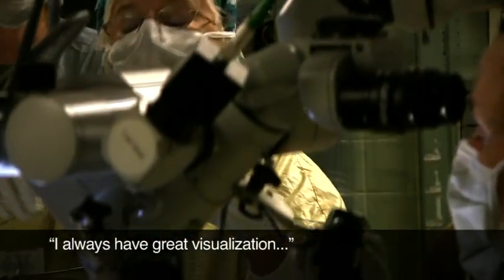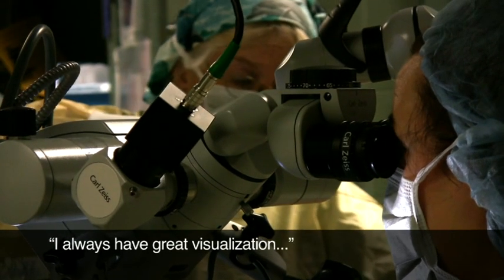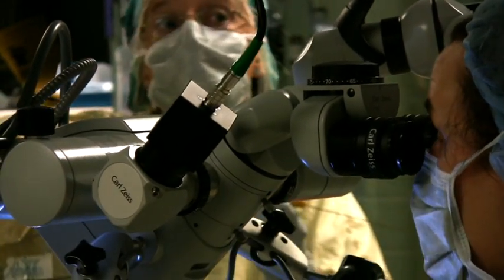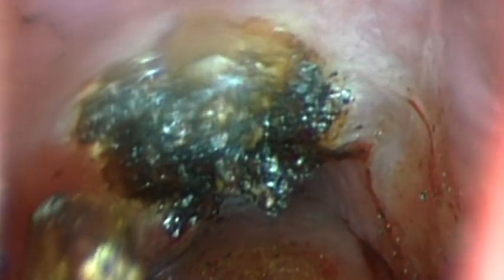I always have great visualization. The plume doesn't build up in the laryngoscope, so I can always see really well, and it helps a little bit with bleeding too. It pushes the blood out of the way and that also makes me feel safer.